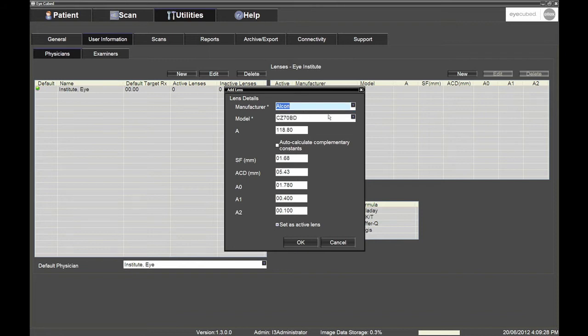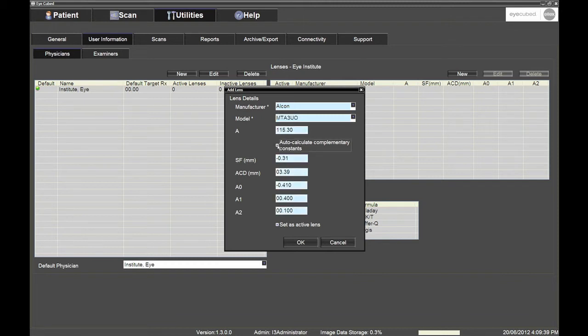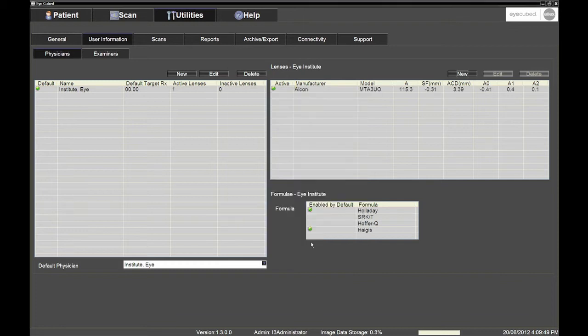You then have the option to either select some pre-entered lens models or to manually enter new lenses. For the lens details which are to be entered manually, if the user has only provided you with the name of the manufacturer, the lens model and the A constant, you will have the possibility to auto-calculate the complementary constants by ticking the Auto-Calculate Complementary Constants box. The lenses that are set as active lenses will be automatically included in the IOL report. Please note that there is no limit to the number of lenses that can be associated with a physician's file.